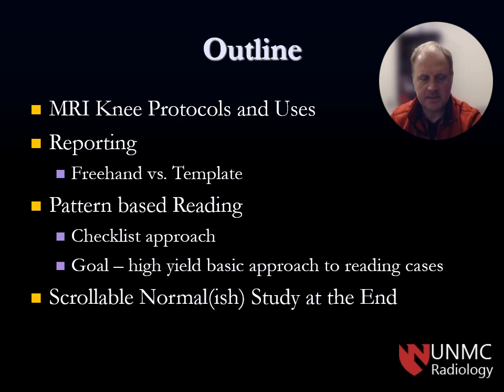The outline is going to be the following. We're going to discuss a little bit about MRI basic protocols and uses. I'm going to discuss reporting, which is freehand versus template reporting, two different approaches to reading MRIs. It basically comes down to personal preference, which one you use. Both are fine. We're going to use a pattern-based reading approach, which is predominantly going to be a checklist approach.